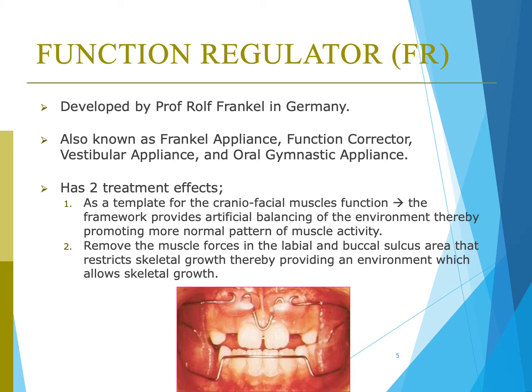The Frankel appliance has two main treatment effects. First, it serves as a template against which the craniofacial muscles function. The framework of the appliance provides an artificial balancing of the environment, thereby promoting a more normal pattern of muscle activity. Secondly, the appliance removes the muscle force in the labial and buccal area that restricts skeletal growth, thereby providing an environment which enables skeletal growth.